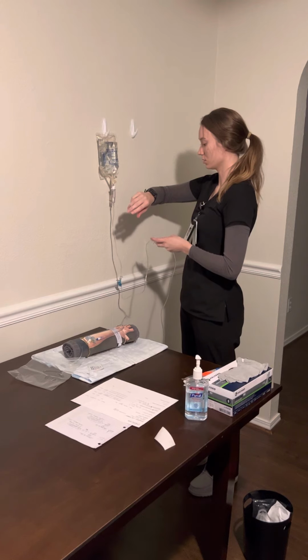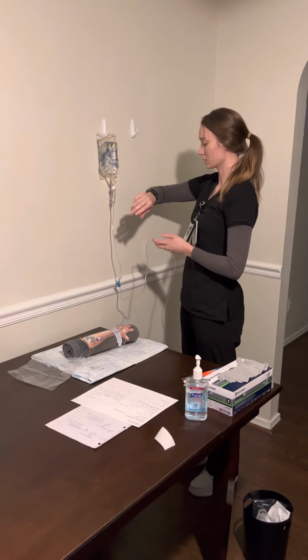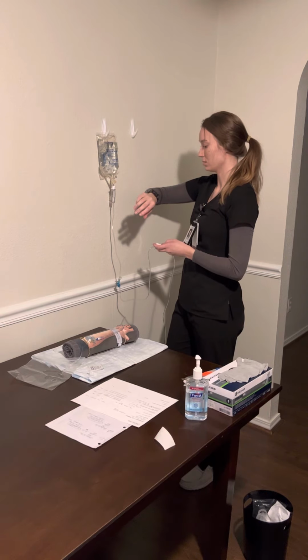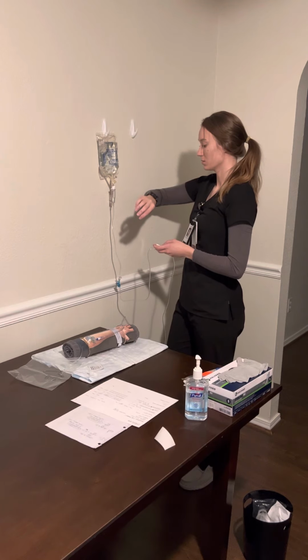One, 2, 3, 4, 5, 6, 7, 8, 9, 10, 11, 12, 13, 14, 15, 16, 17, 18, 19, 20, 21, 22, 23, 24, 25, 26, 27, 28, 29, 30, and 31. So that looks good.